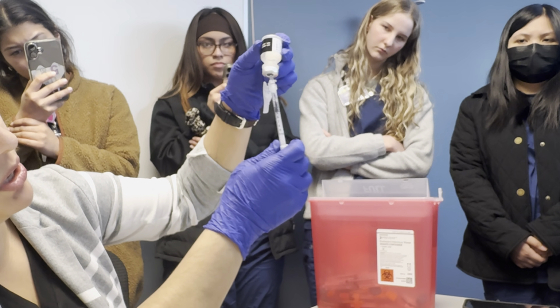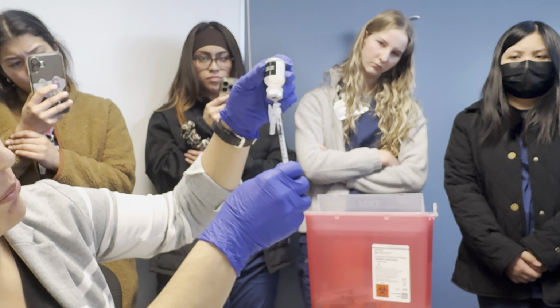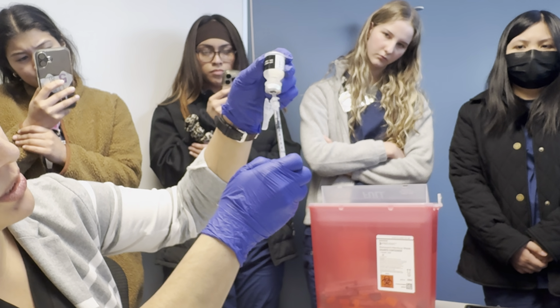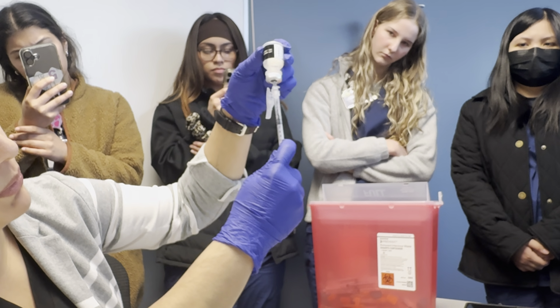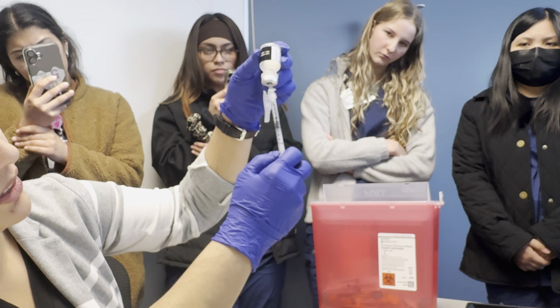I'm at 0.3. I only want 0.1 because there's a bubble I have. My goal is to get rid of that bubble. So I'm putting a little bit more medication in here, and then I'm going to push this back in to meet 0.1. I still have a bubble. I don't like it, so I'm going to pull my medication back a little bit more. See if I can get rid of that.